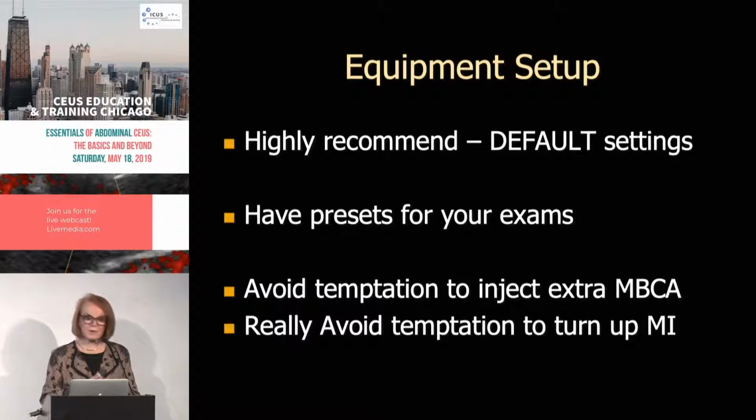Now, as Richard mentioned, one of the things that I really love, and one of the first ultrasound machines that was great for doing contrast, was in fact the Acuson Sequoia, not when it was owned by Siemens, but when it was just the Acuson Sequoia. And what I loved about that machine was that someone came and showed me almost nothing, and you just could push the button to put the contrast on, and then do the scan, and it didn't really matter what you did. It didn't matter whether the focal zone was in the right place or the wrong place. It worked well, and it showed excellent discrimination of masses from the background liver.